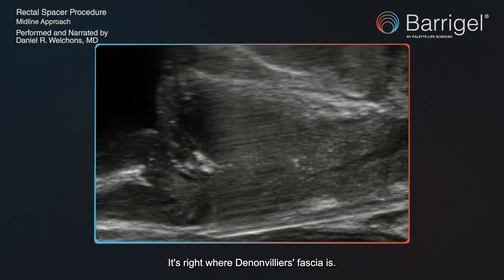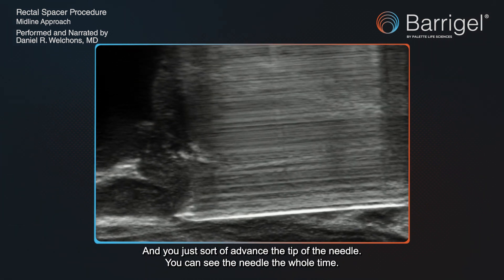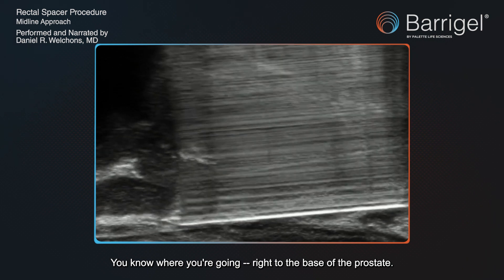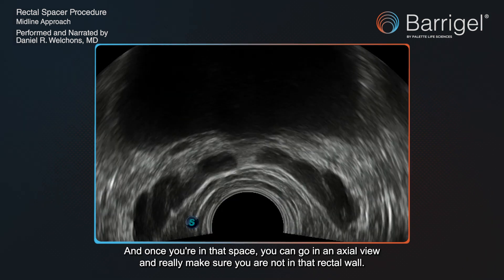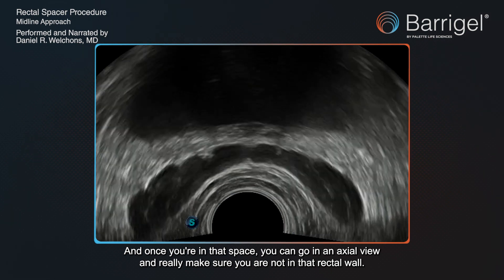It's right where Denonvilliers' fascia is, and you just advance the tip of the needle. You can see the needle the whole time — you know where you're going, right to the base of the prostate. Once you're in that space, you can go to an axial view and really make sure you are not in that rectal wall.